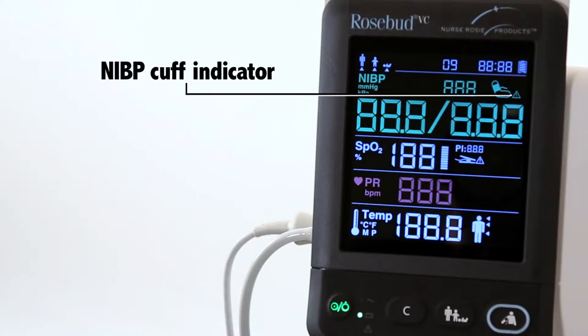The NIBP cuff indicator will display when errors such as air leak, incorrect air pressure, weak signal, overpressure, incorrect cuff type, or excessive patient motion occur.